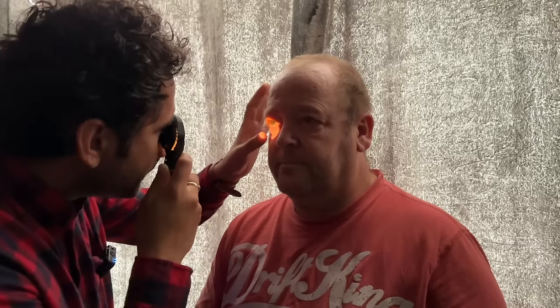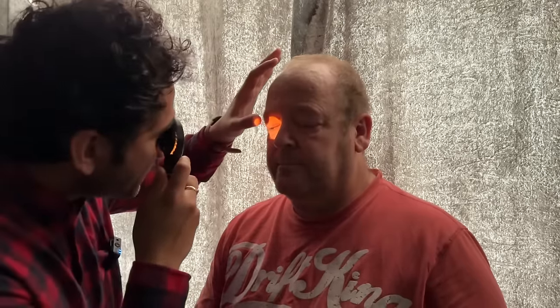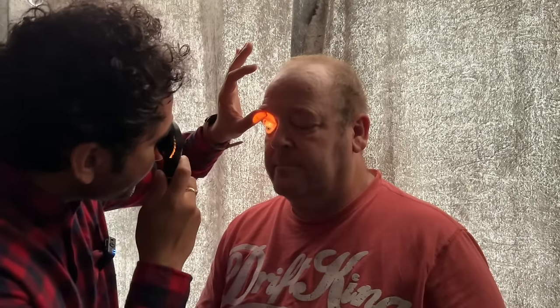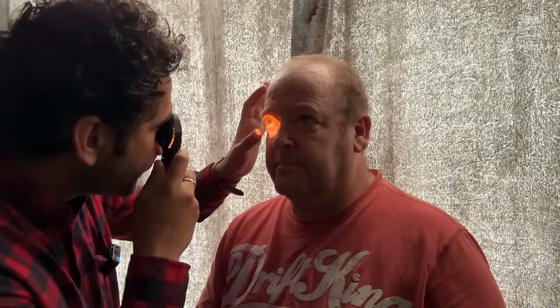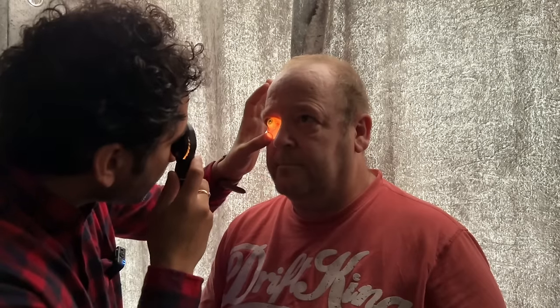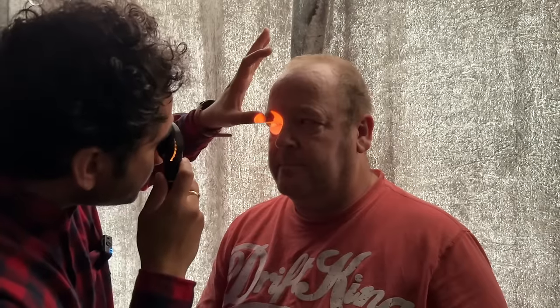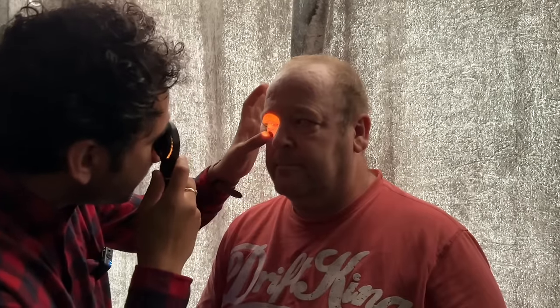I'm just going to lift the lid around the lid areas. Look up. Remembering to change your focus to get the best view. Now focusing our attention on the sclera and the conjunctiva — looking at that white surface and the blood vessels that live there. Looking up, now to your left, and to the right, covering all those zones and checking for any pathology. Now looking straight ahead.